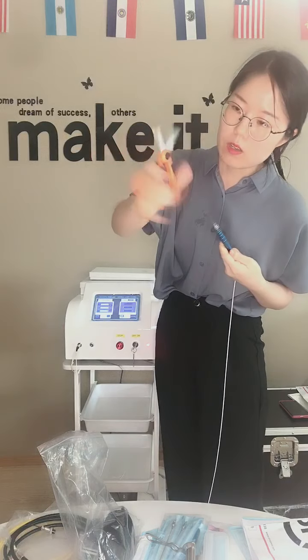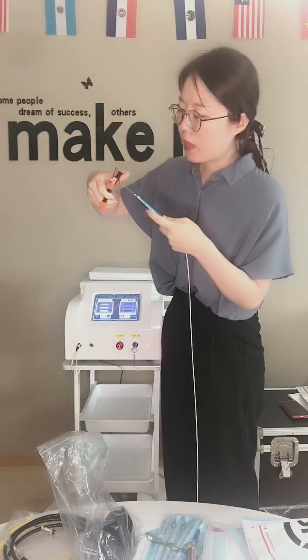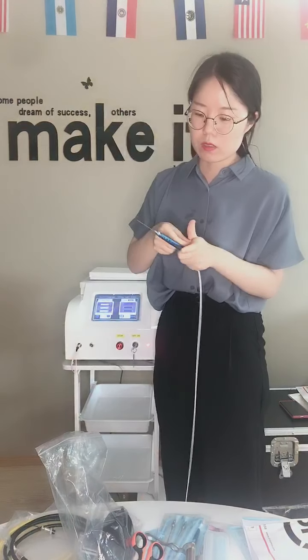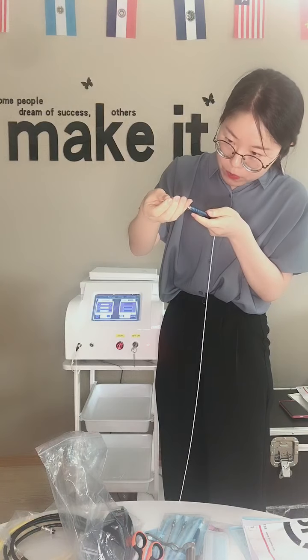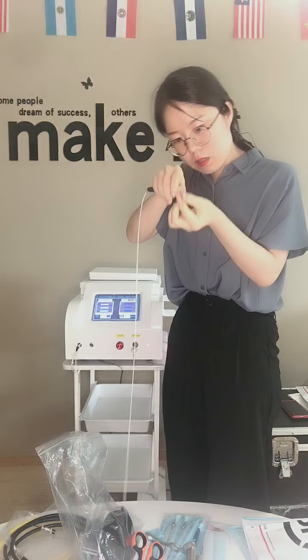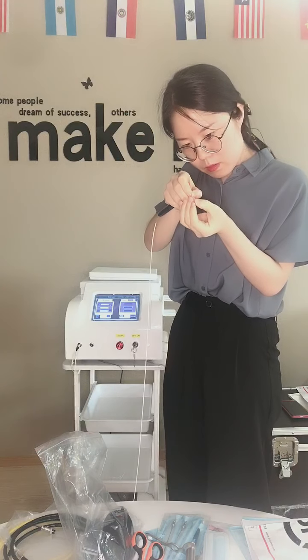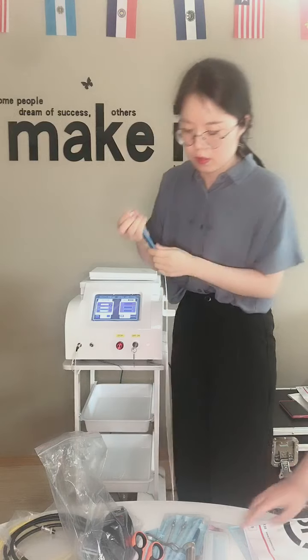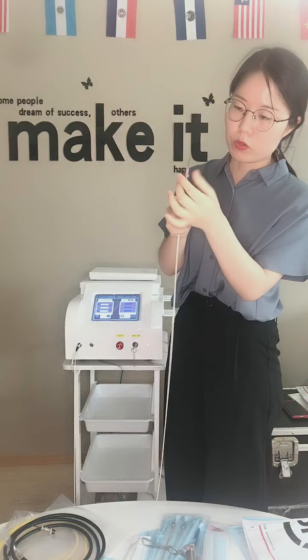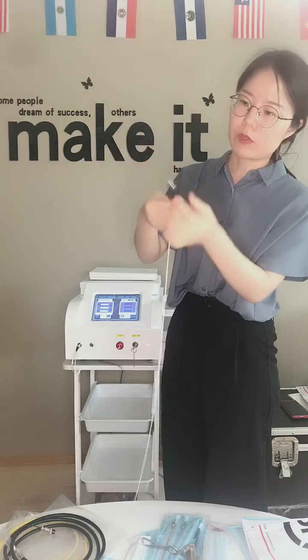You can see this is the scissors you will receive, and this is a professional one for cutting the fiber. And I will cut the tape here so that I can get the needles in. Because just now the fiber burned, it made it very bigger. Okay, fine. And when you put on the empty needle, you need to tighten this place. So the fiber is very tight here, you can't get it out.